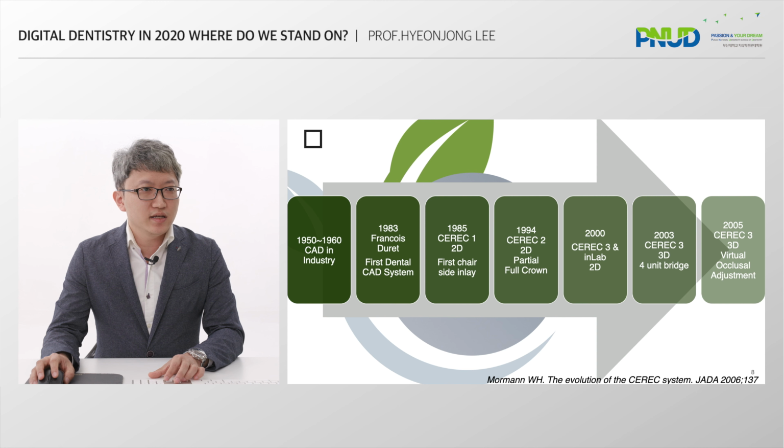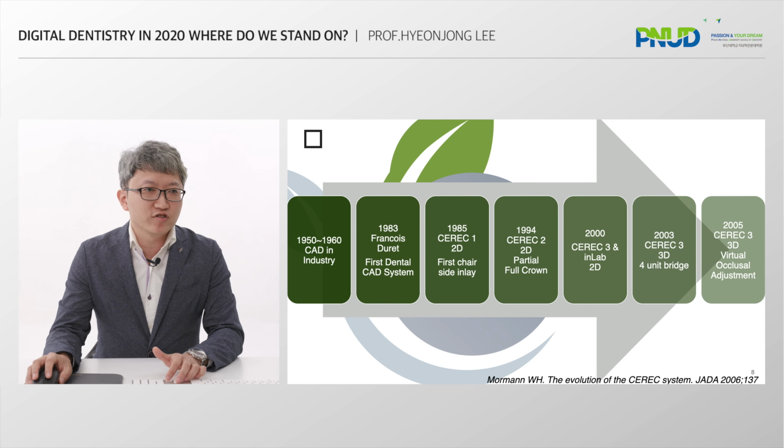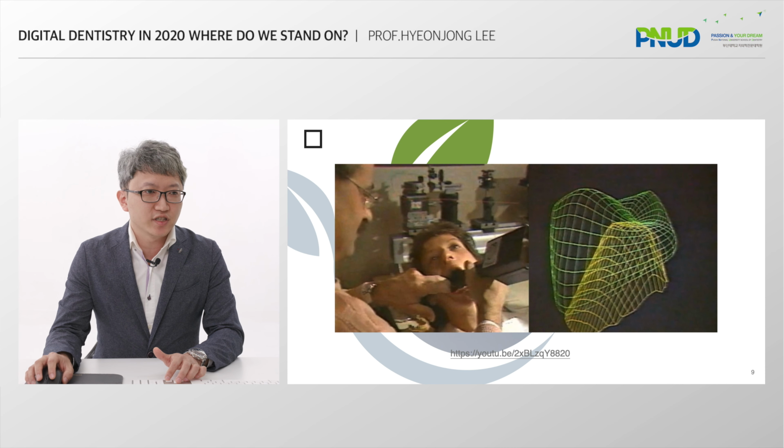In the 90s and 2000s, CEREC was developed into CEREC 2, CEREC 3 and inLab. After that, CEREC 3 had a 3D virtual occlusal adjustment function.